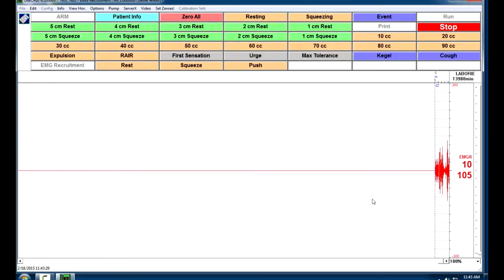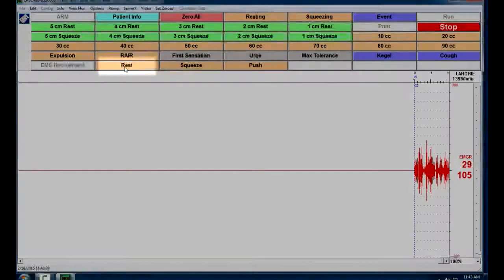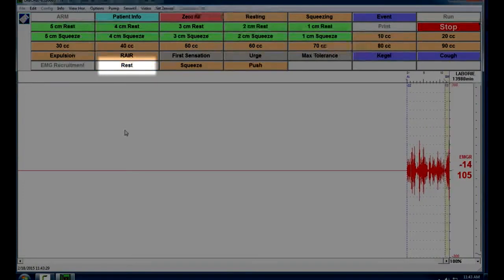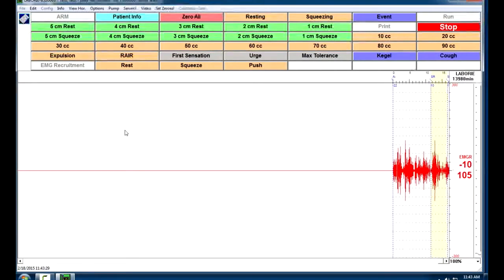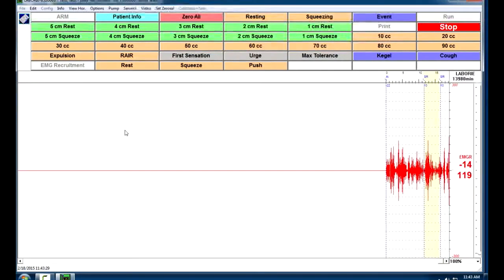We'll ask the patient to just sit quietly to make sure everything's working correctly. And then while they're just laying there, we're going to click the rest button. And again, it's going to count off for about 5 seconds or so, and the patient will just be resting. They don't even need to know that you're doing it.